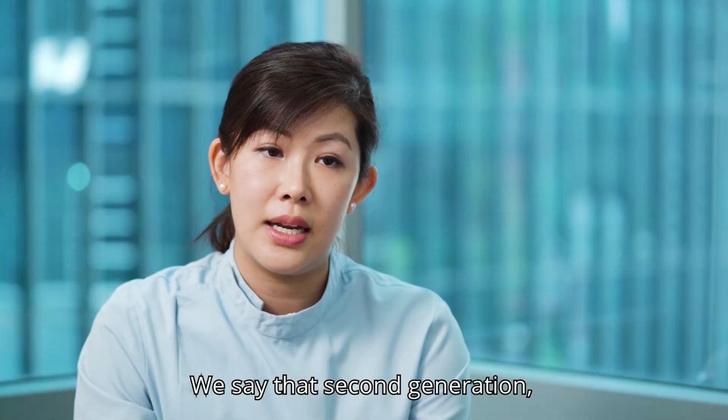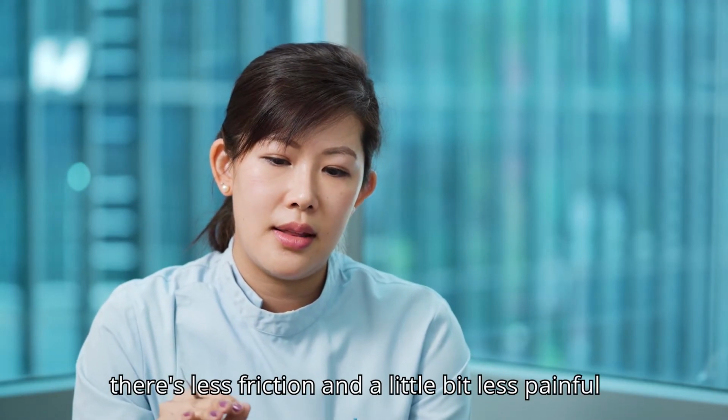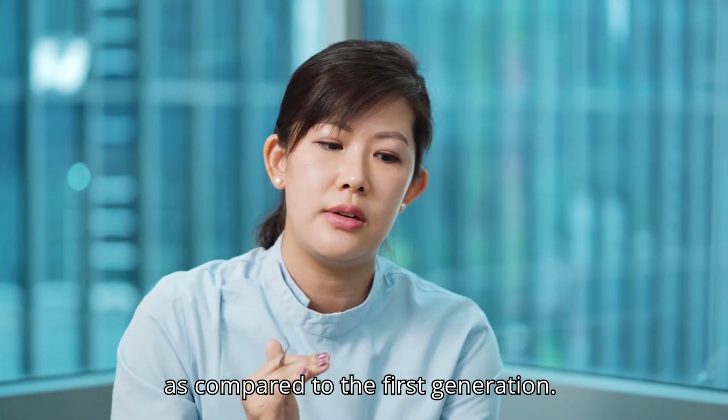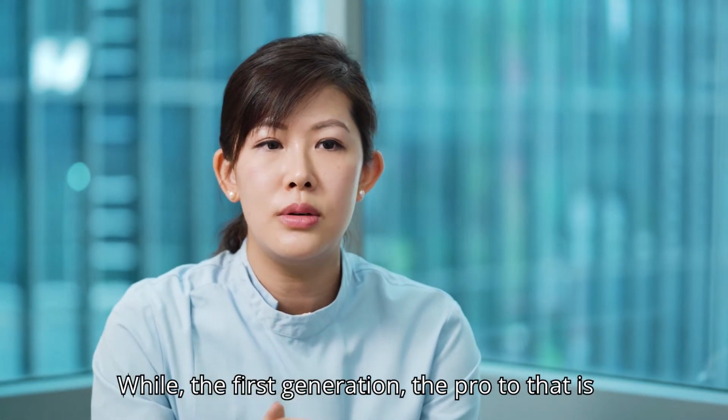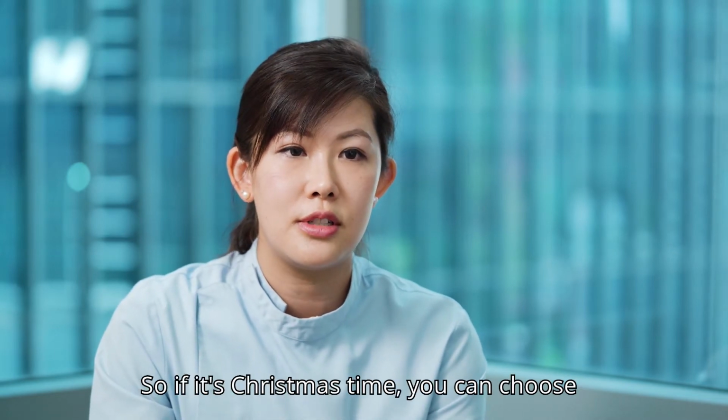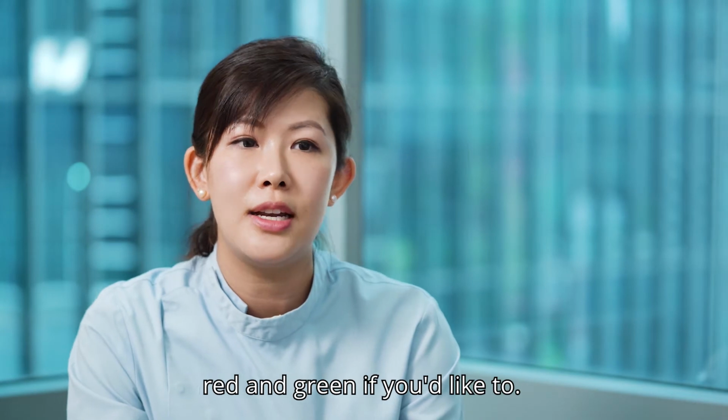Second generation, the self-ligating ones, there's less friction and a little bit less pain as compared to the first generation. Well, the first generation, the pro to that is you can change the colors of the modules. So if it's Christmas time, you can choose red and green if you'd like to.